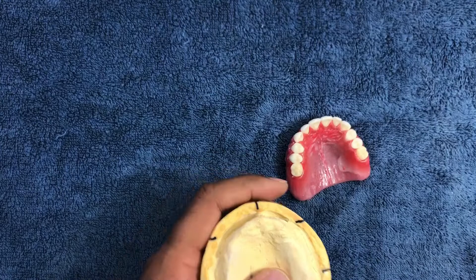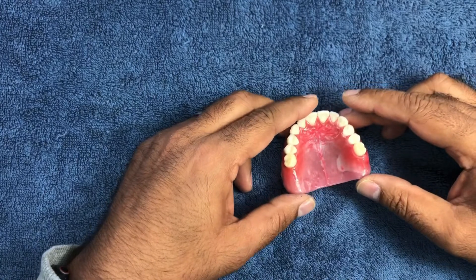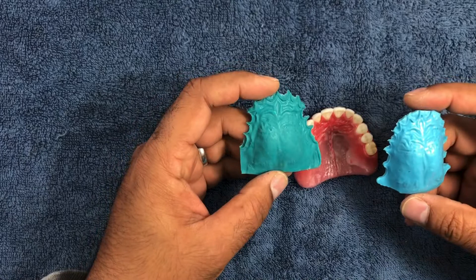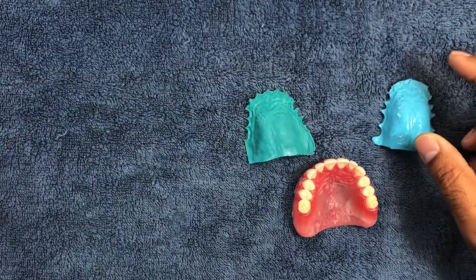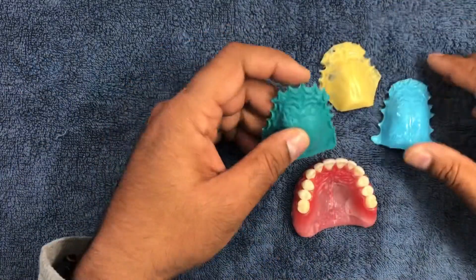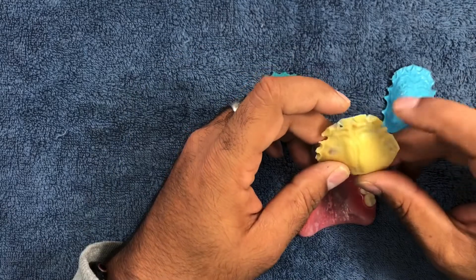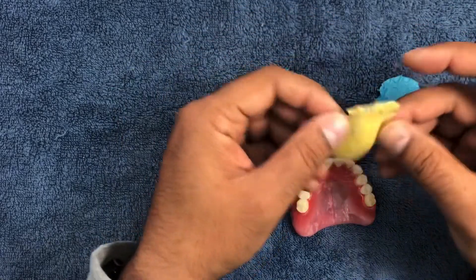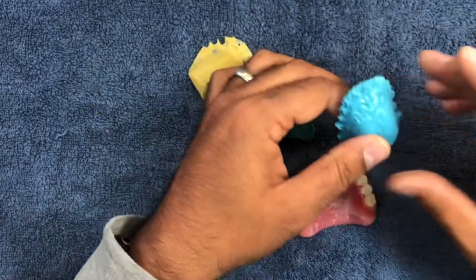Patient acceptance comes when they feel the same as their original tissues. The second way of doing it is duplicating the palatal anatomy using old impression materials. I have a light body, medium body, and heavy body — all different consistencies. The heavy or medium body work well because the light body is really hard to control; it's floppy, even though it gives really good detail.